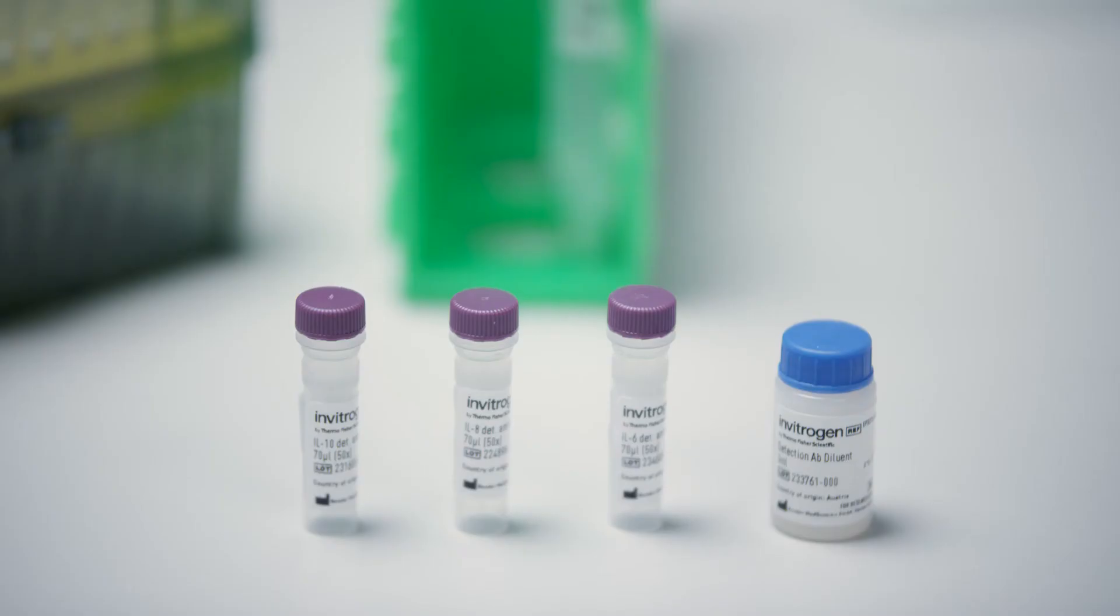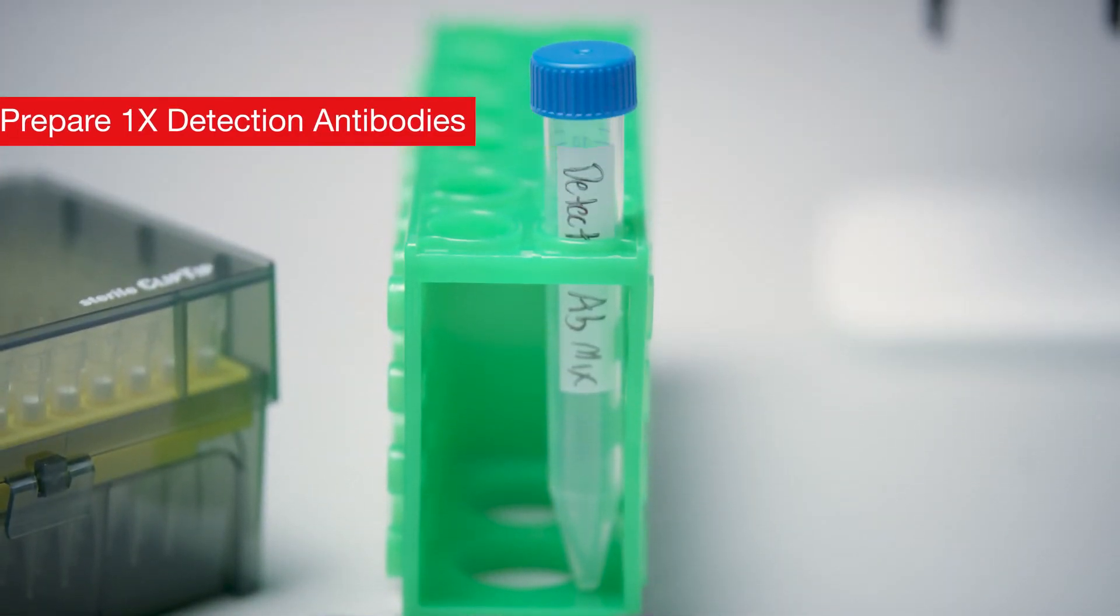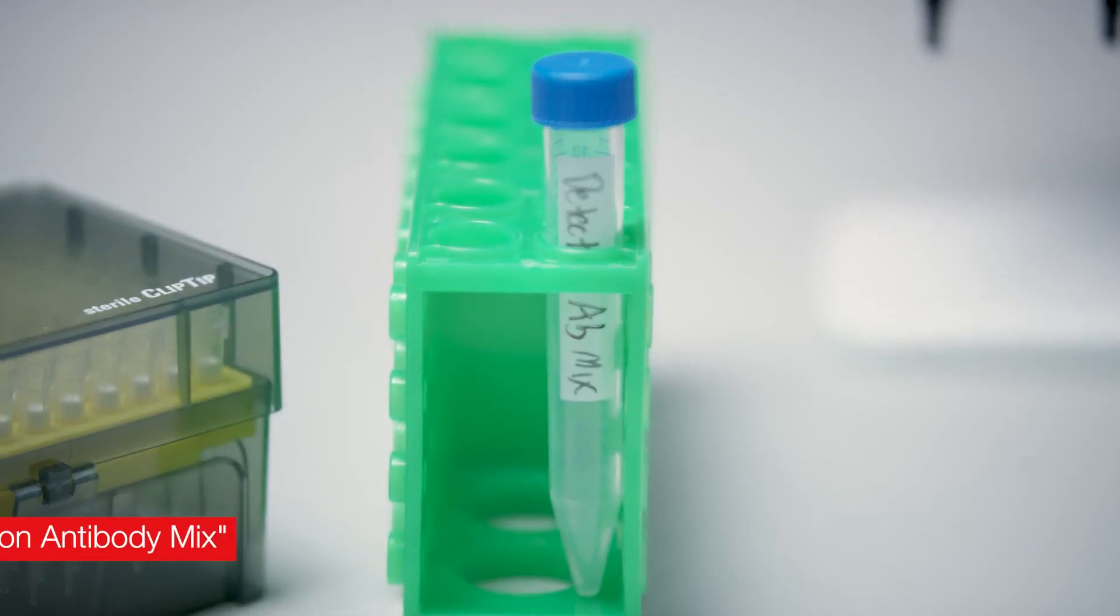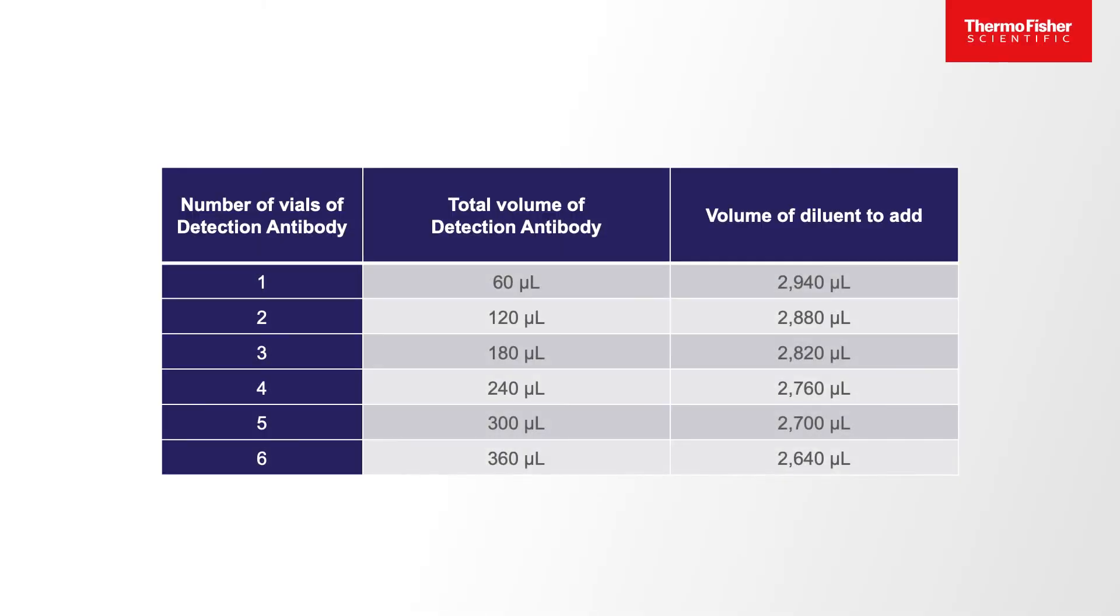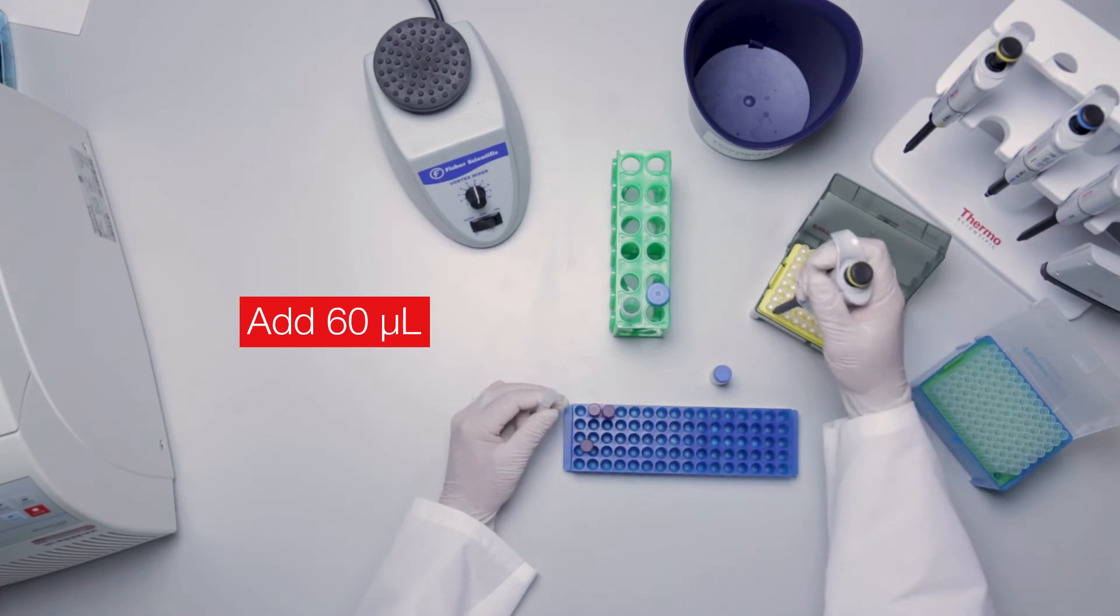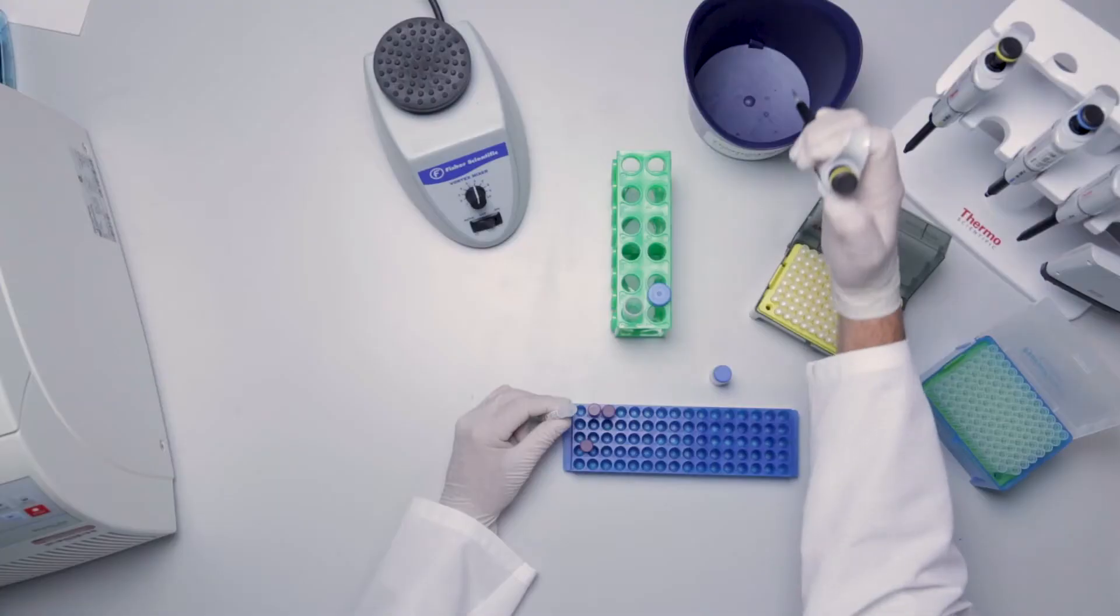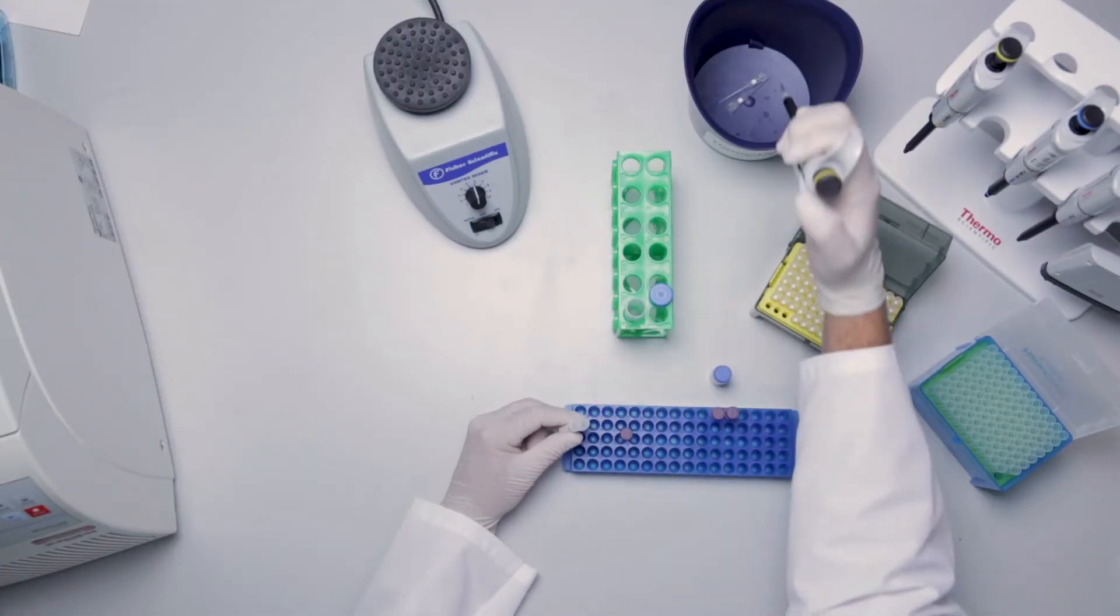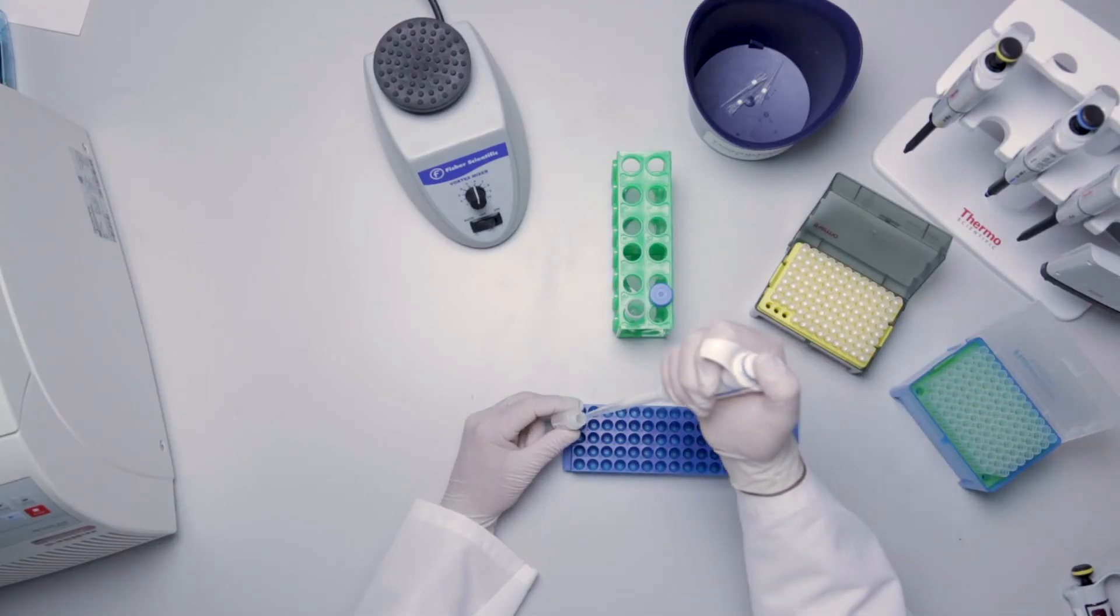The detection antibody in the combinable panels is provided at a 50x concentration. Label a 15 milliliter tube as detection antibody mix. Use the provided table in the manual to check the needed volumes for a full 96 well plate. Scale accordingly if using a partial plate. Add 60 microliters of each detection antibody concentrate to the labeled tube and bring the volume up to 3 milliliters using detection antibody diluent if using a full 96 well plate. Otherwise adjust the volume accordingly.